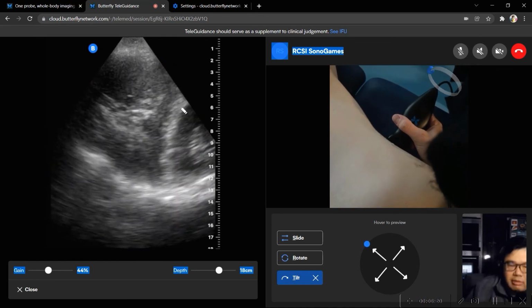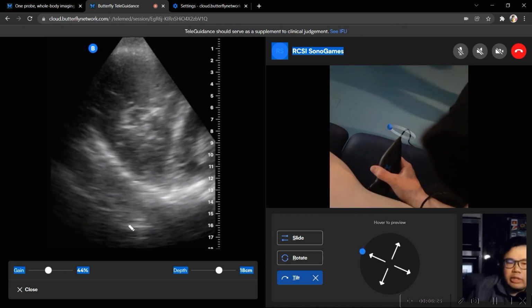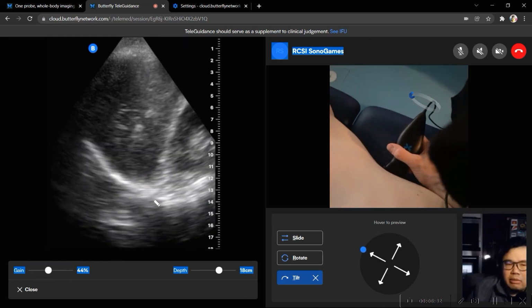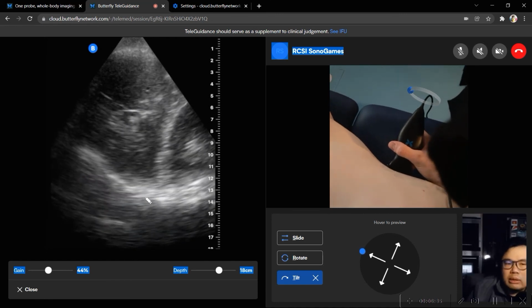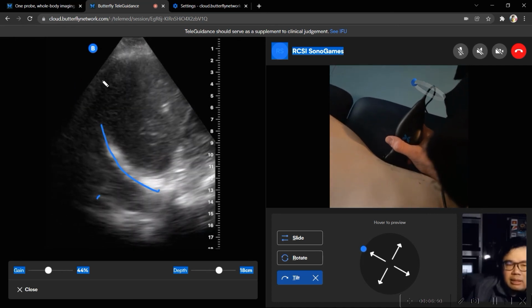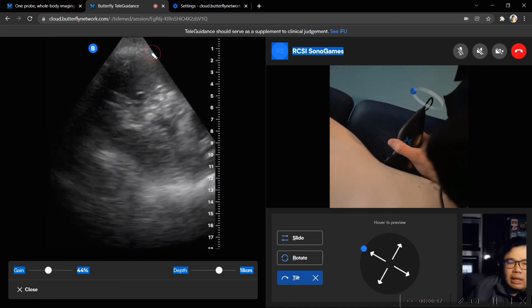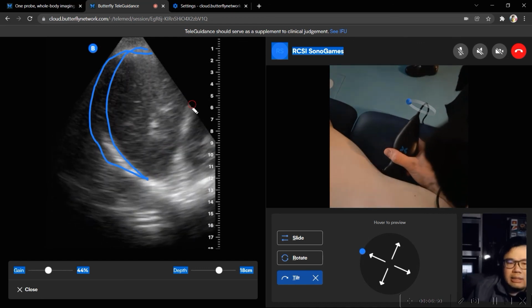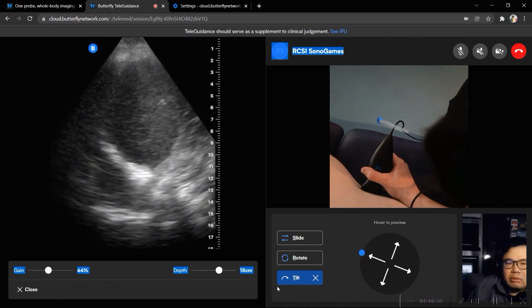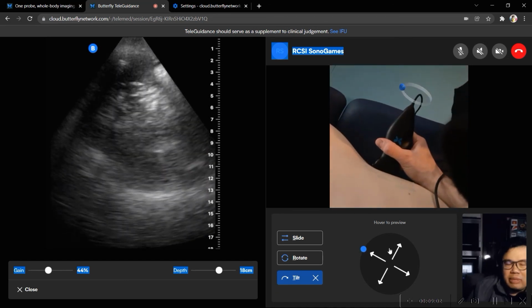But anyway, regardless, there's no fluid up here. Where's the fluid going to be if it was in the left upper quadrant in the abdomen? It would be behind the spleen? Behind the spleen, or between the spleen and the kidney? No, it will preferentially be between the spleen and the diaphragm, because this space is actually very loose compared to this space. So if there's blood or anything like that, it tends to track in that area as opposed to over here. I can say with relative confidence that there is no free fluid between the spleen and diaphragm. Perfect. Excellent. That's great.